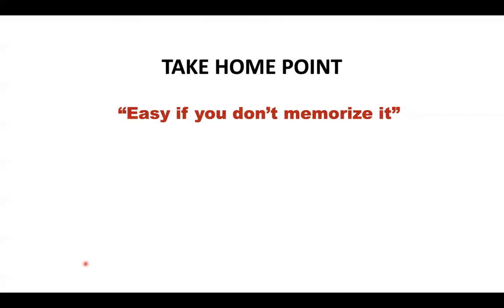Students, as take-home points, you can learn about the ECG itself by yourself very easily. Easy if you don't memorize it.